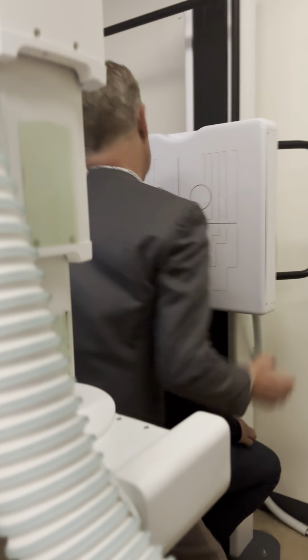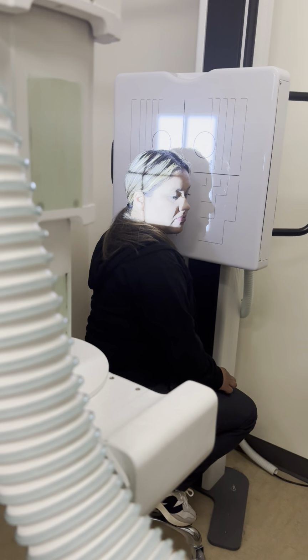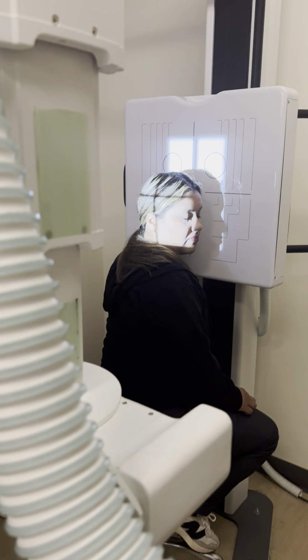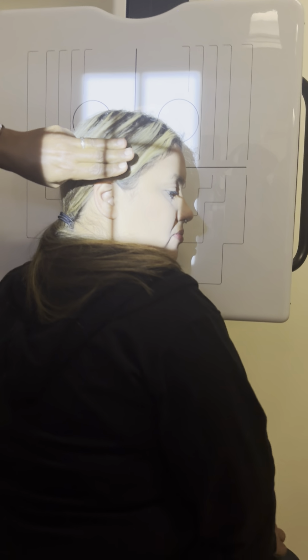Make sure she is mid-sagittally set up. So this is a lateral. Hang on a second. And then I'll go back to what we were asking about, LaToya. She wants a picture of it. So you find that, and then you go 2 inches above, and that's the easiest way to do it. You're absolutely right. So you find the hole and just go up.